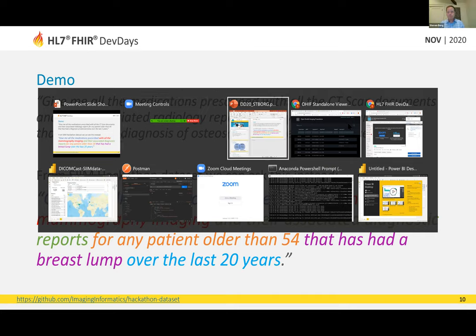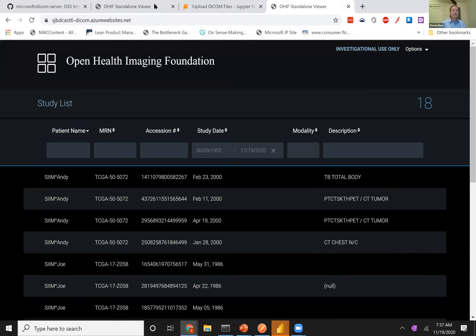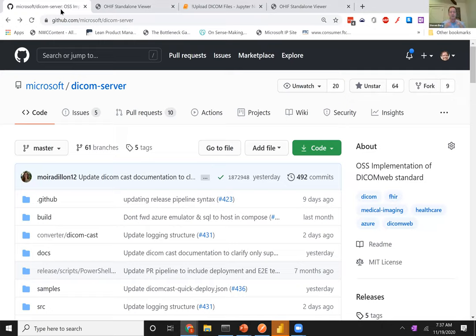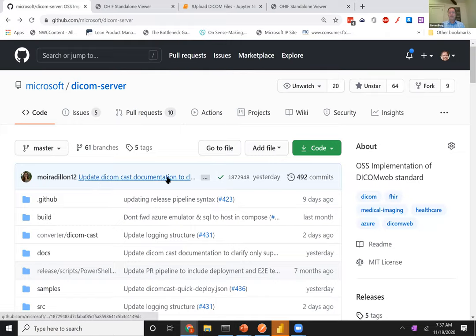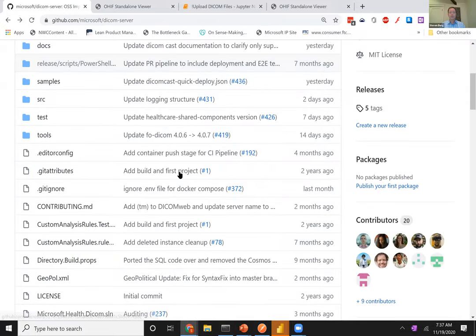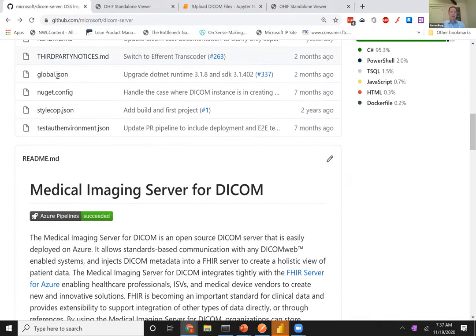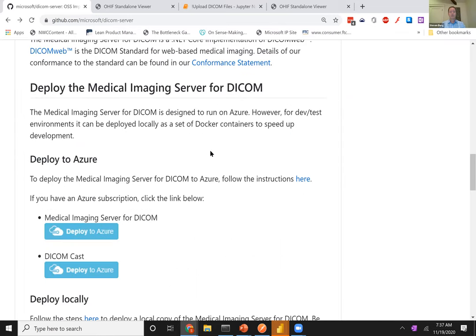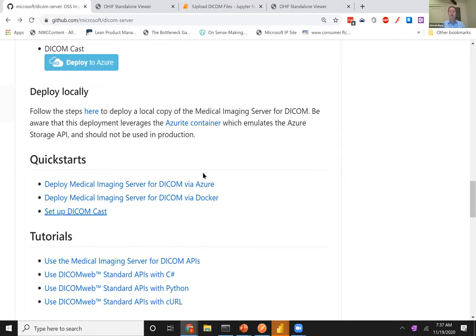Let's get into the demo, starting with the DICOM service itself. Here in the DICOM server at github.com, Microsoft's DICOM server repository — you can see we recently updated some of the DICOM Cast documentation to make it easier to jump in. The medical imaging server for DICOM has quick starts here, and if you want to see what it's like after this session, these quick starts are how you get started quickly. I'm going to set up DICOM Cast.